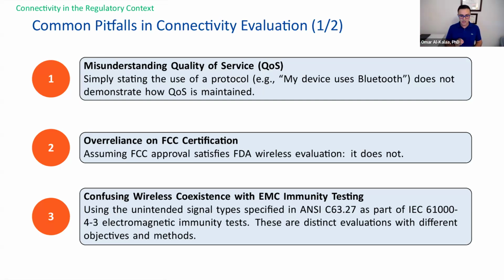Wireless coexistence is not an EMC immunity test. It is, as of today, not a part of the EMC test standards. There is a specific standard for how to test wireless coexistence. The process of testing wireless coexistence is fundamentally different from the process of testing a device for immunity. So please don't confuse the two topics. They are complementary. They are not one and the same.